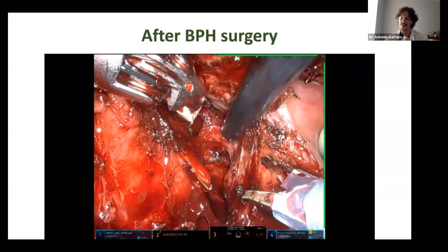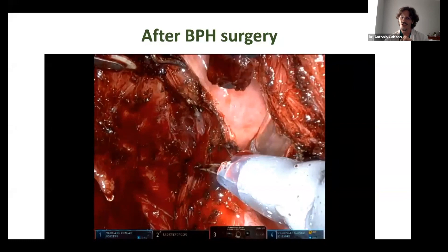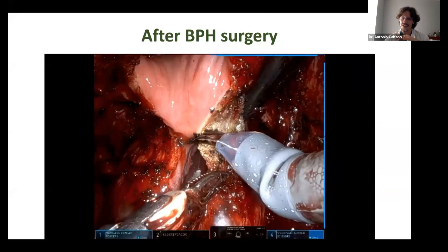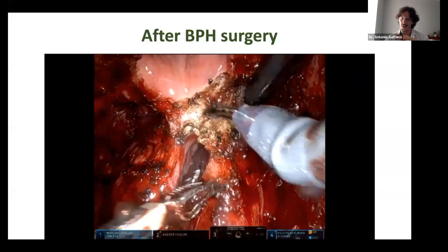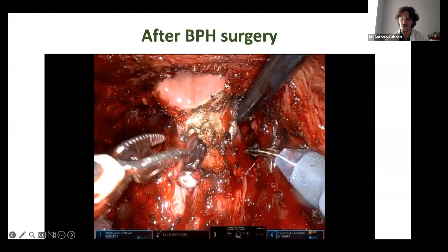I know this is not a usual view, but when you see 20, 100, 1,000 procedures, you will always see the same planes. Here we are on the anterior part of the bladder neck, and this is the final view of the bladder neck dissected after urethral division.